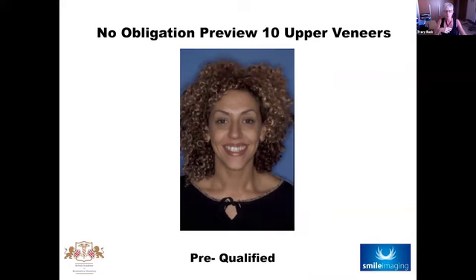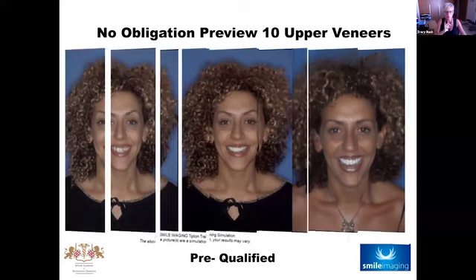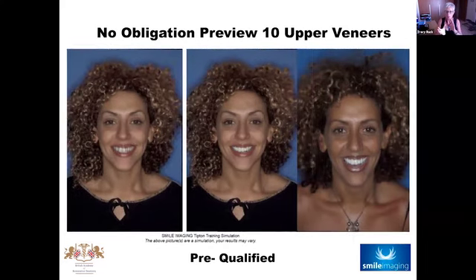So here we have a beautiful case that Professor Paul Tipton has allowed us to share with you again today. This is an upper 10 veneer case. Now, this lady was presented to Paul and she wanted to go with the veneers. She's got quite an off-center midline, and Paul discussed with her about shifting that, or we could keep it the same and do the veneers. So she decided that she would like to take a look at not having orthodontics and how the smile would look. So we've imaged that case for Professor Paul Tipton.